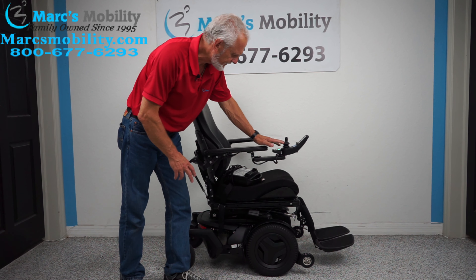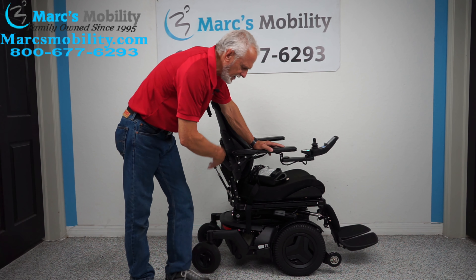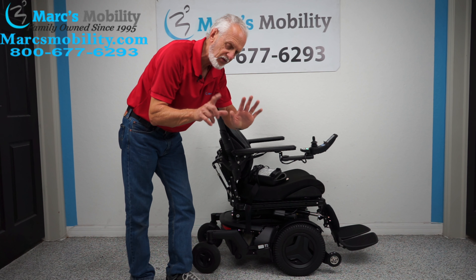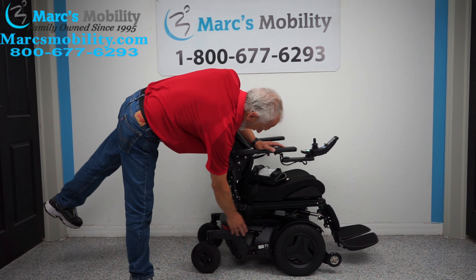We have another beautiful chair here. This is a Permobil F3 power chair, front wheel drive. This power chair has seven miles, so it was used less than a week. The color is matte black — everything is black. It really looks sharp.